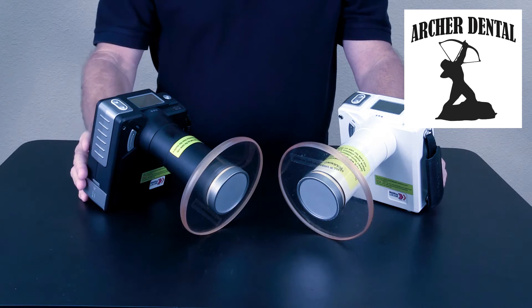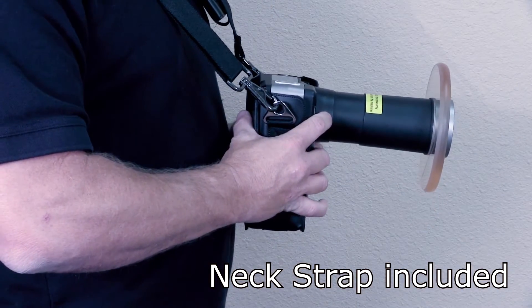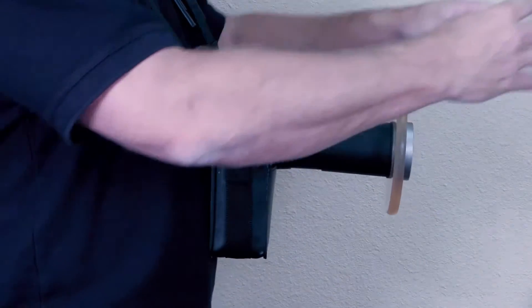These units can be neck strap mounted for easy op-to-op use, allowing easy hands-free positioning.